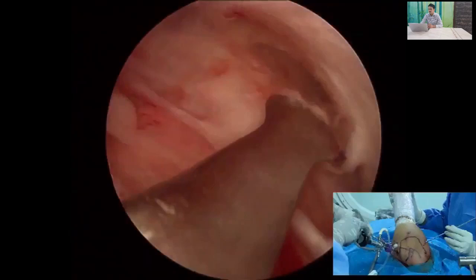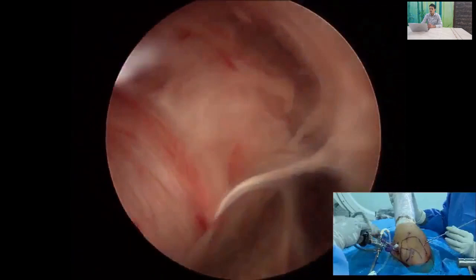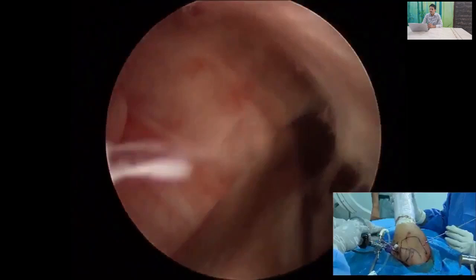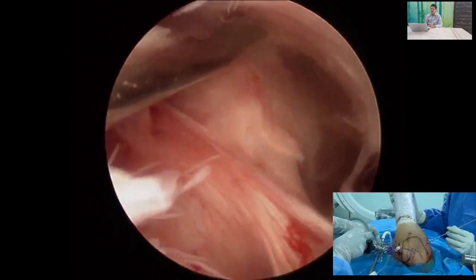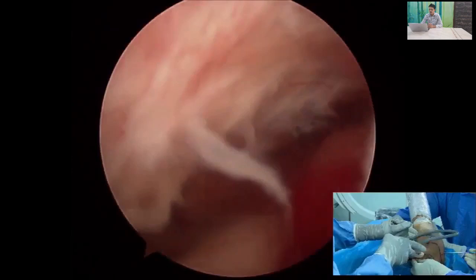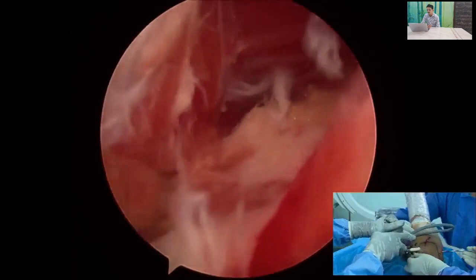Release the tissue from top to bottom, go up to the six o'clock position, and you can even go more inferiorly — release as much tissue as possible. The more you do the release, the more you'll be able to bring the capsulolabral complex back to its normal level, because it has healed in a more inferior position. The whole labral complex is much more medially attached to the glenoid neck, so release is very important.